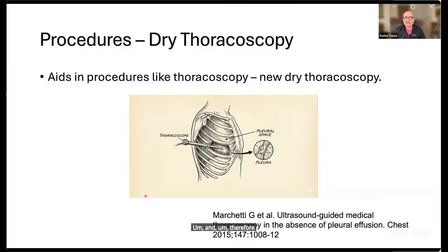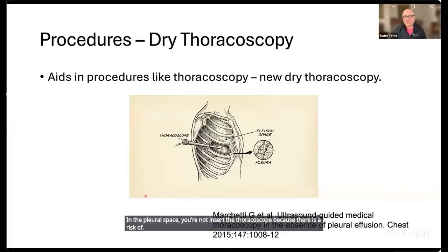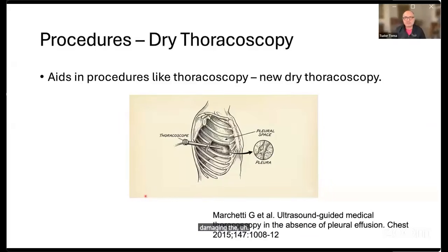Therefore, the standard was that if you don't have enough fluid in the pleural space, you would not insert the thoracoscope because there is a risk of damaging the lung, creating bronchopleural fistulas and so on. That's a much more complex complication than just not being able to do the procedure.